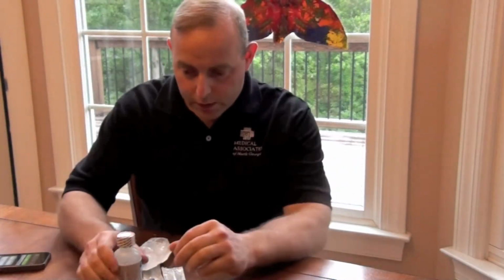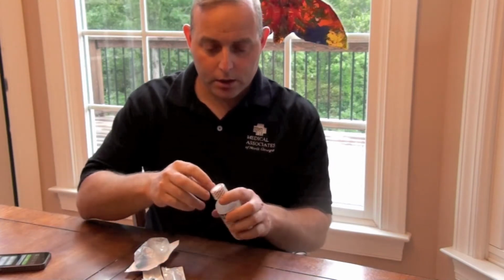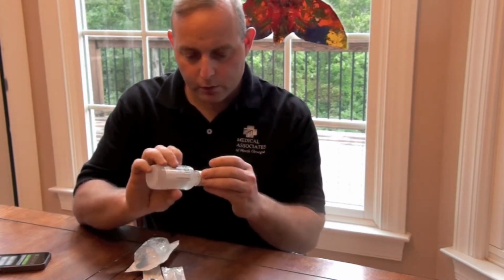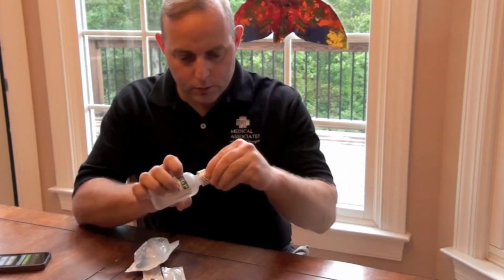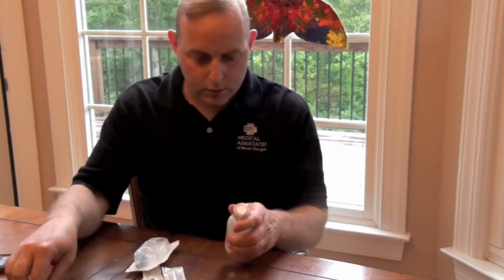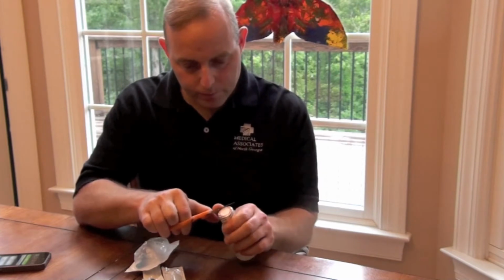Alright, I wanted to detail how we make the sphenopalatine ganglion block kit. This is for patient use at home. The hard part will be getting off this child-proof seal, and having scissors handy may be helpful.